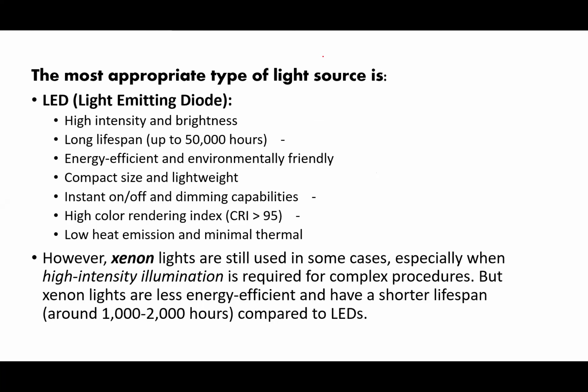It has high intensity and brightness. Its long lifespan makes LED superior to other sources. It has energy efficiency, is environmentally friendly, compact and lightweight. It has instant on and off, dimming capability, a high color rendering index of greater than 95, low heat emission, and minimal thermal effects.